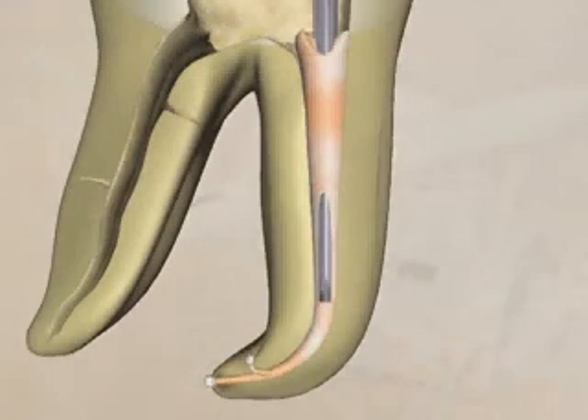Deep in the canal space, the heat is cycled off. Downward pressure is kept on the cooling carrier. This continued pressure in turn exerts pressure on the gutta-percha, forcing it into more lateral canals and anastomoses. After several seconds and when the carrier has reached its ultimate depth, a second one-second burst of heat is applied.